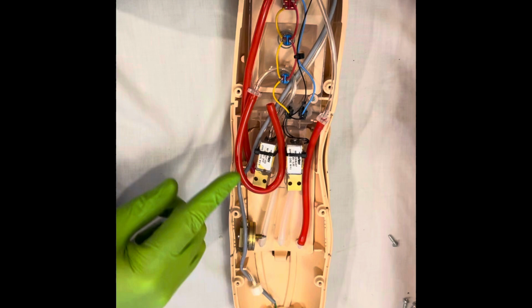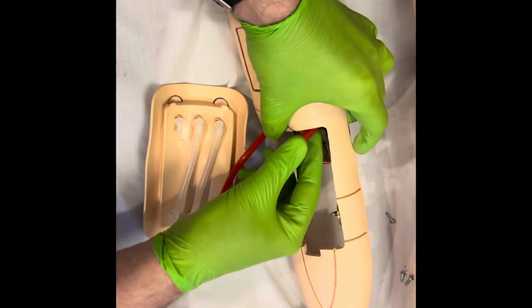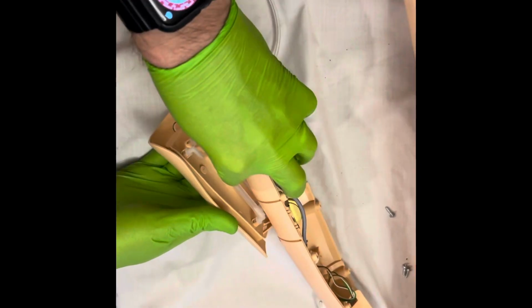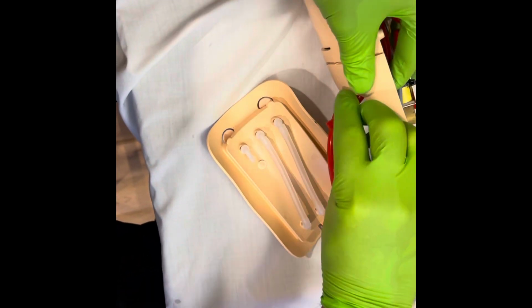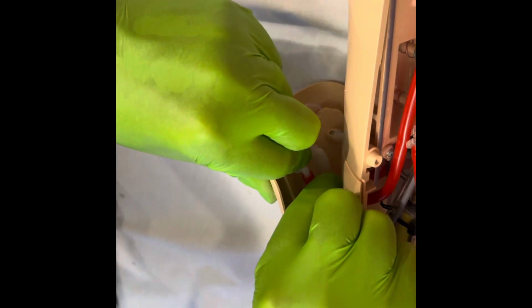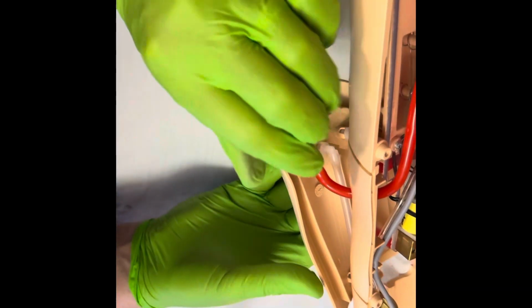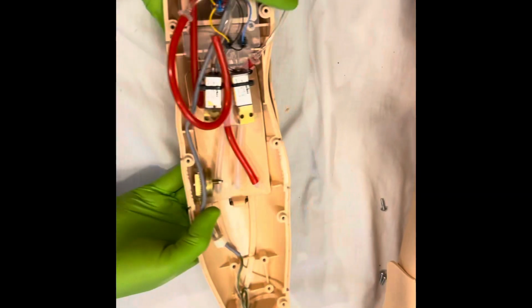And now we can connect where the hose goes. This hose to the upper part of the arm. It's a little tight, but you can get it on. So it might even be easier to hook it up the opposite way, so where you hook up the entrance port last. But I can make this work. Be very careful with these fittings. They want to turn and break off, so I would recommend bracing it as you're putting it on. So, okay, just for now, I'm going to store it in there.